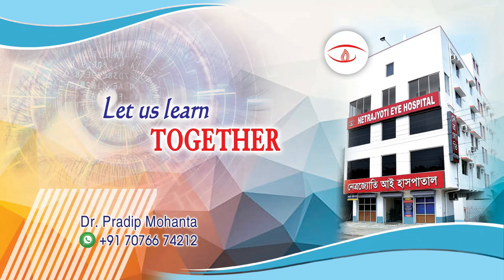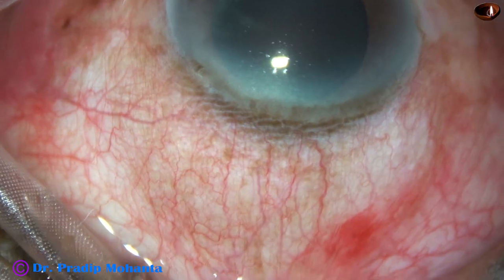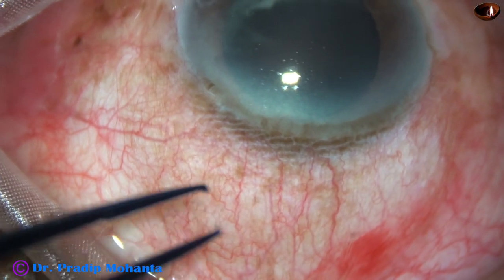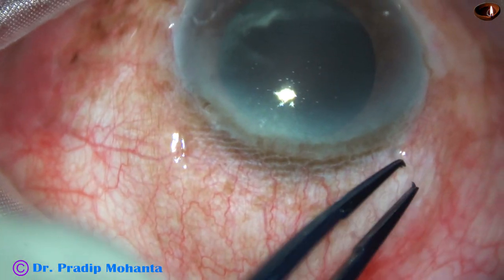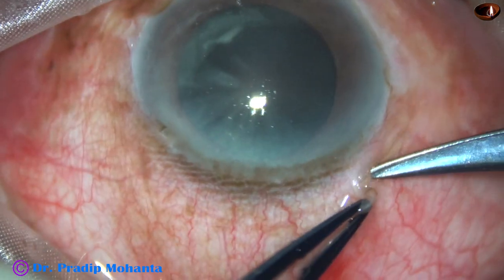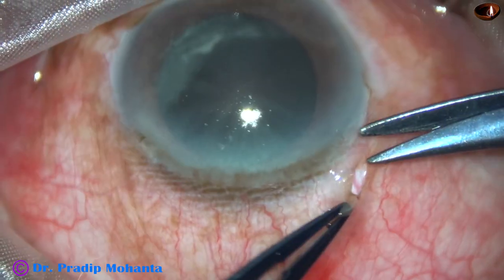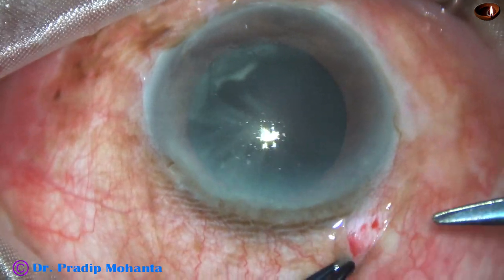Friends, let us learn a large incision cataract surgery together. This is a black cataract, cataracta nigra. FACO is possible in this case, but there can be endothelial cell loss to a significant extent. There can be posterior capsular rent and nucleus drop. A lot of complications can occur in FACO, so it is a safe option to do large incision cataract surgery in such cases.